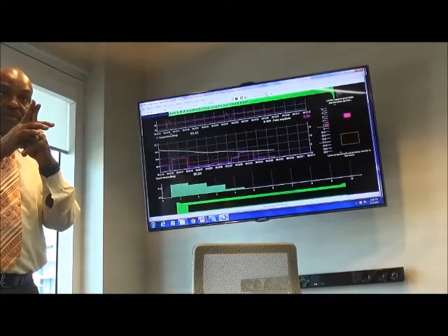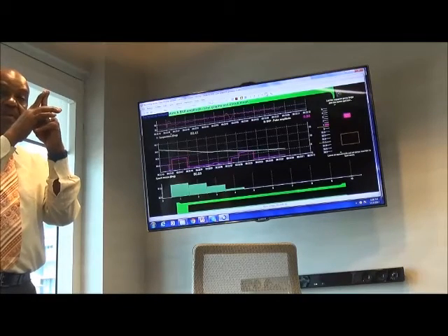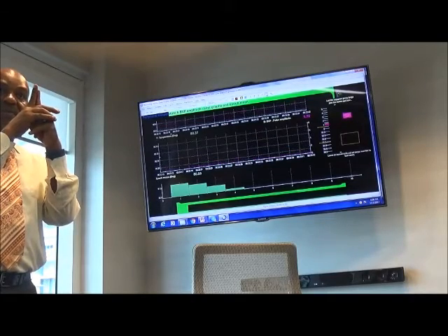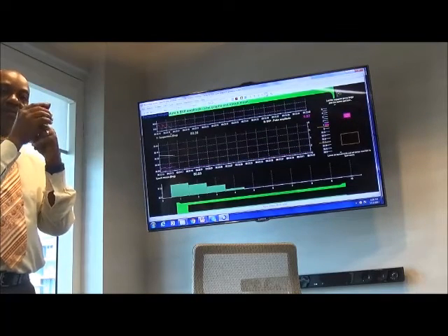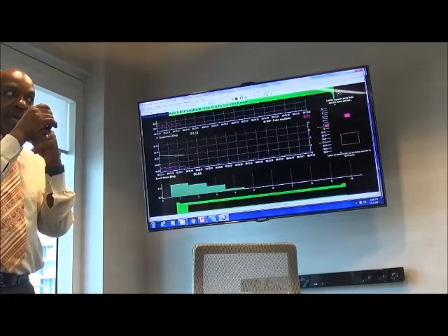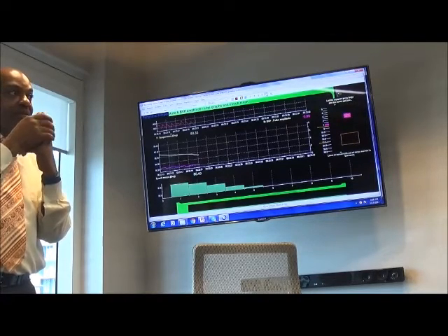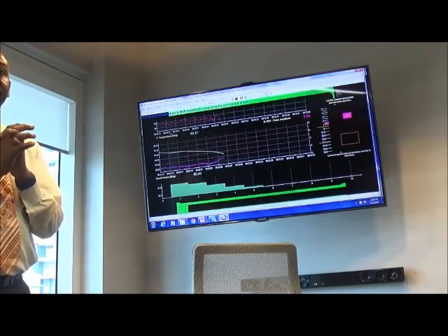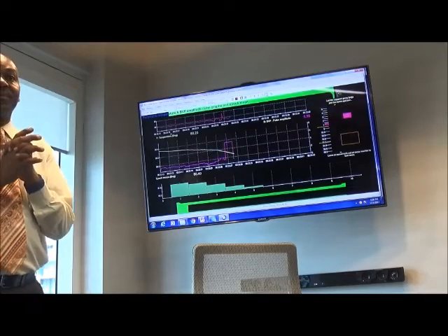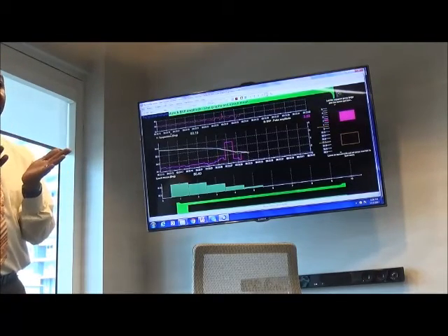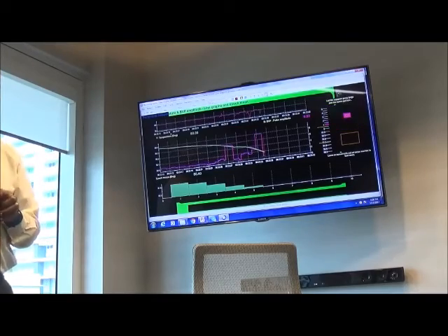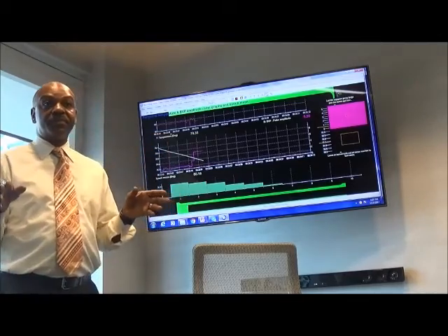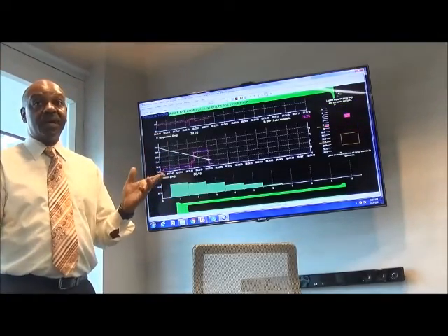So if the, like Dr. Palacios was saying about having the sensor lower down so it's really making contact with the finger. If it's up here, it's really getting the air temperature. And if the tape or whatever you're using is too tight, it's constricting so you're getting less blood flow. So that'll decrease the temperature. He also said I was laying my hand palm down and it was picking up my leg temperature. Right. So that would be an artifact. That's an important point. Where should you put your hand? Palm up. Palm up. We talked about the temperature of the room. So if the room is too cold or too hot, that would cause an artifact.